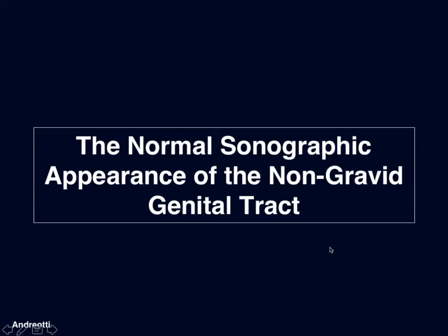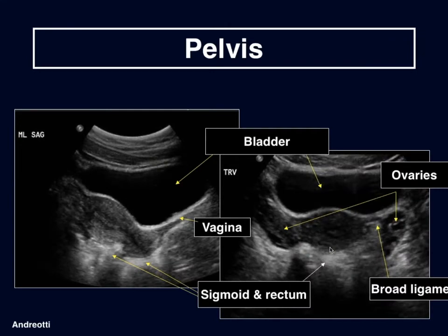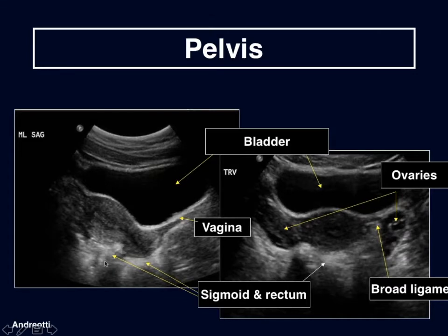Let's look at the normal sonographic appearance of the non-gravid genital tract. Our typical transabdominal image shows the bladder anterior, uterus in the sagittal plane — seen posterior to the distended bladder and anterior to the rectum and sigmoid back here, which is seen only as dirty shadowing due to the gaseous contents of the bowel. We could also see that behind the uterus in the transverse plane.